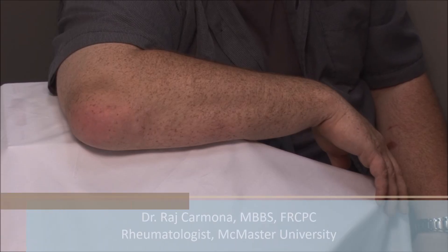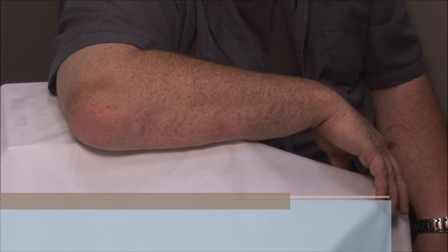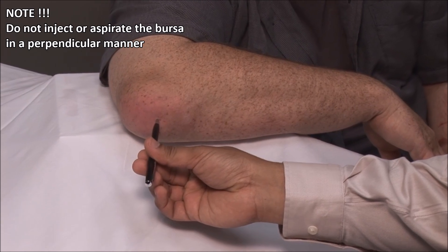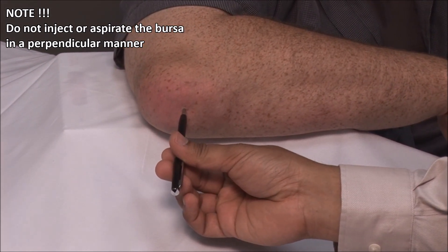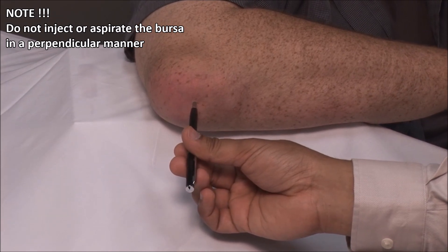This patient has gout with an inflamed olecranon bursa containing tophi and free fluid. Injection of the bursa should never be done in a perpendicular fashion. This can lead to recurrent drainage each time the patient flexes the elbow and can also act as an entry point for infection.